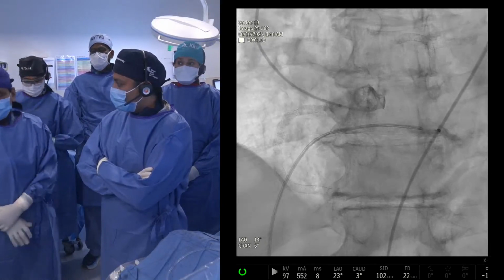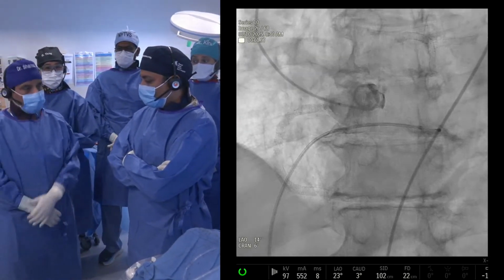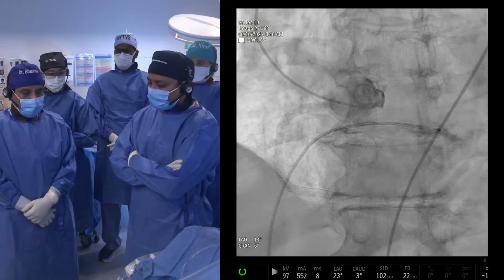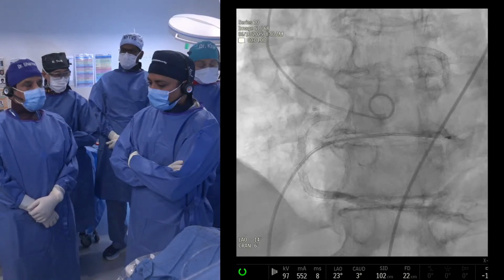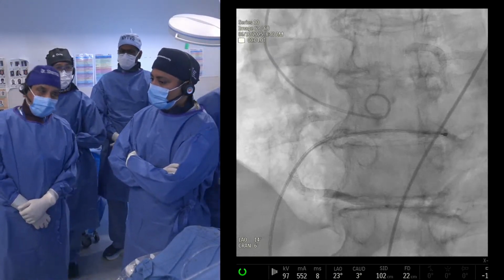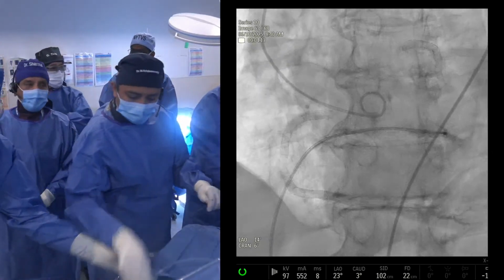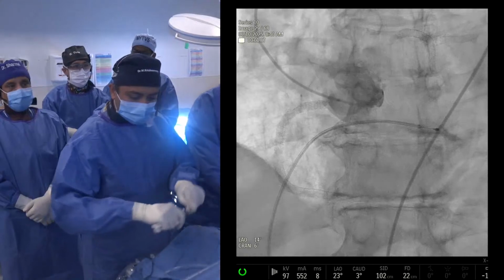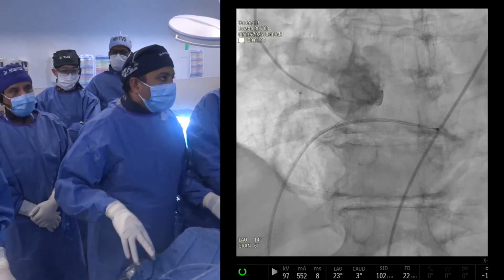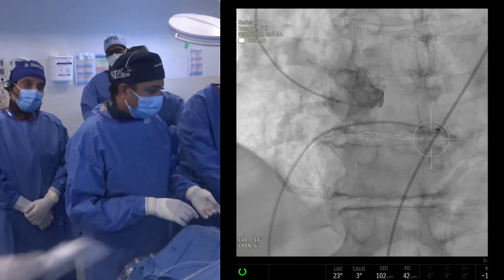No, I think I'm just hearing everyone, sorry for a little delay, but those are very, very great points. The question always comes up, and I always remind that our teaching has been, with complex CAD and severe aortic stenosis, and at least if there is a good favorable anatomy, a lot of people will go for surgical valve replacement and bypass surgery. But at the same time, we have one randomized trial showing that compared with CT surgery, if you do a TAVR and PCI, it is also equally good or maybe better.